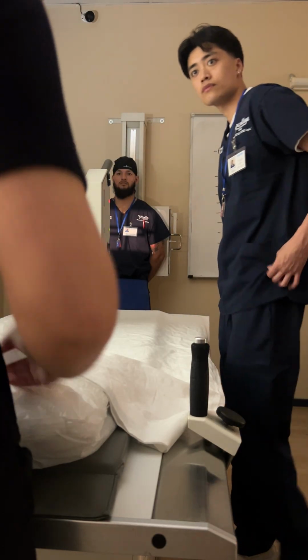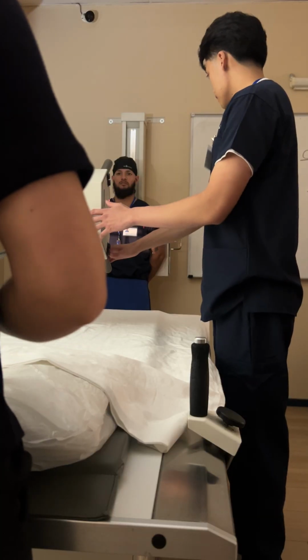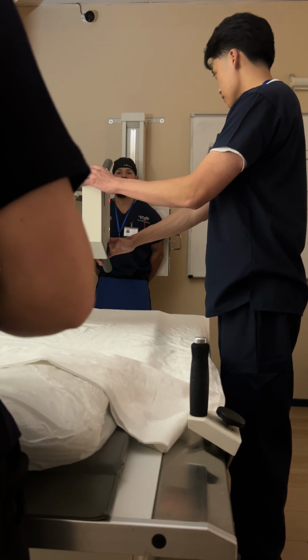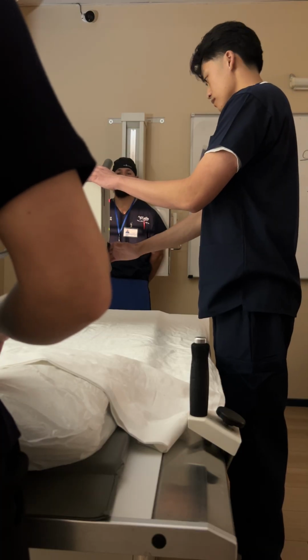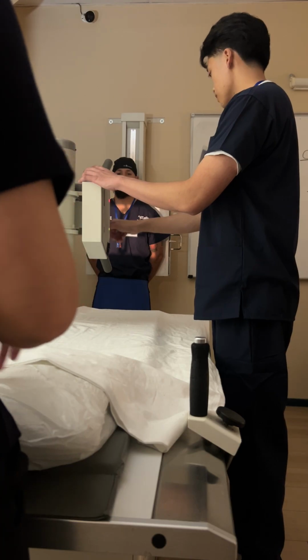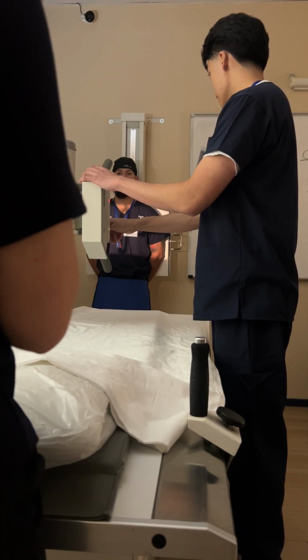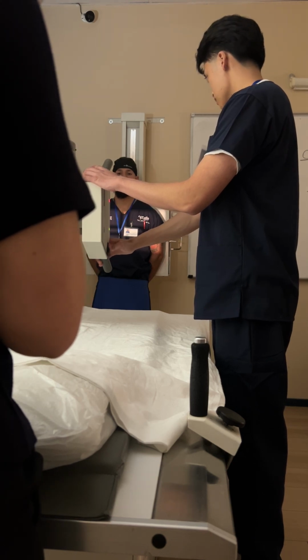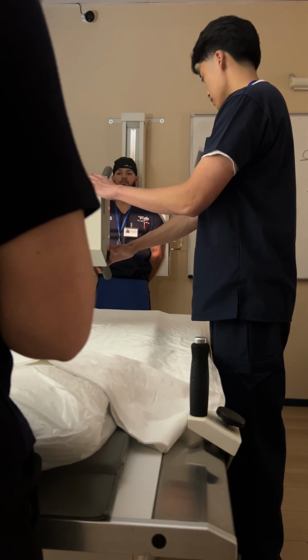Top of the cassette, 1 to 2 inches above the top of the shoulders, okay? Let me get that fixed for you. Okay, that feels better. And you can open your collimation up a little bit more, too. From top to bottom, perfect. Okay, as long as we are centered there. Let's see, let me have you lean a little that way. Drop this arm for me.